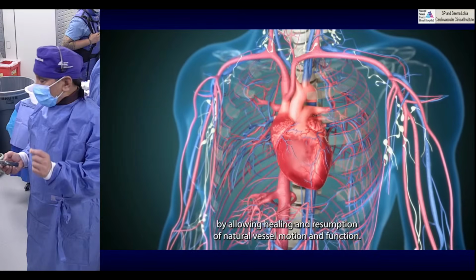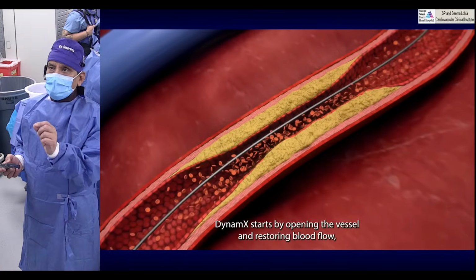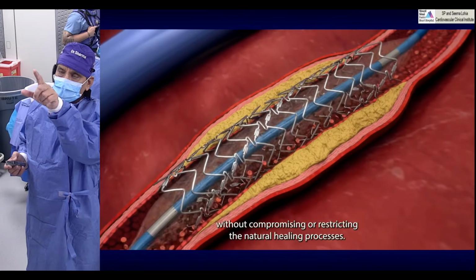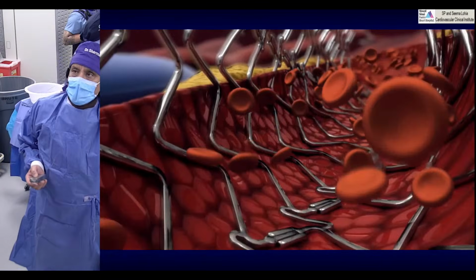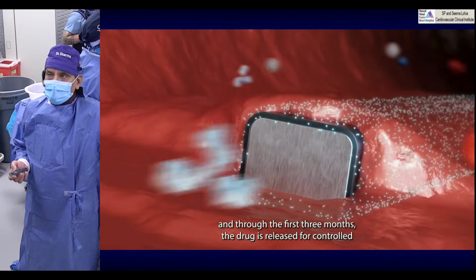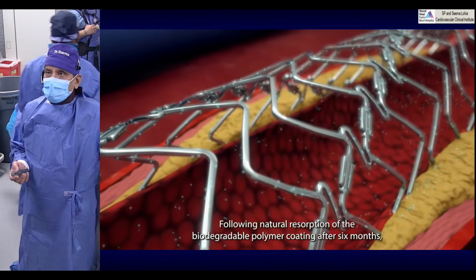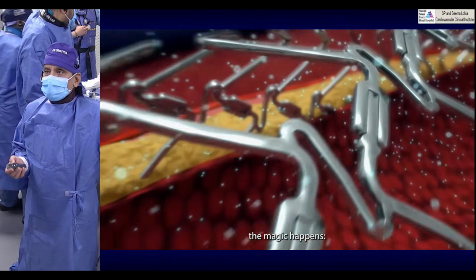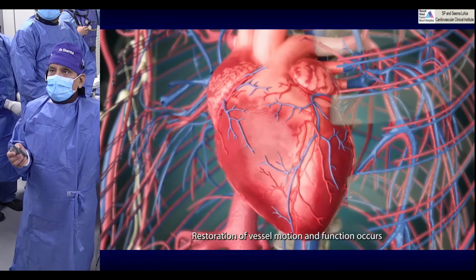Yeah. So basically our stents are usually pure metal. And this is a proprietary design where the Dynamax has a special interconnecting mechanism, you see the interlocks there, and they're covered with sirolimus and a polymer. And the polymer gets dissolved in 3 to 6 months, right? Initially, of course, the polymer is there, your drug is released, and the vessel basically undergoes the healing process. But then after 3 to 6 months, when there is resorption of the biodegradable polymer of the stent, you see what happens. This interlocking mechanism, the stent now can be flexible, no longer rigid.